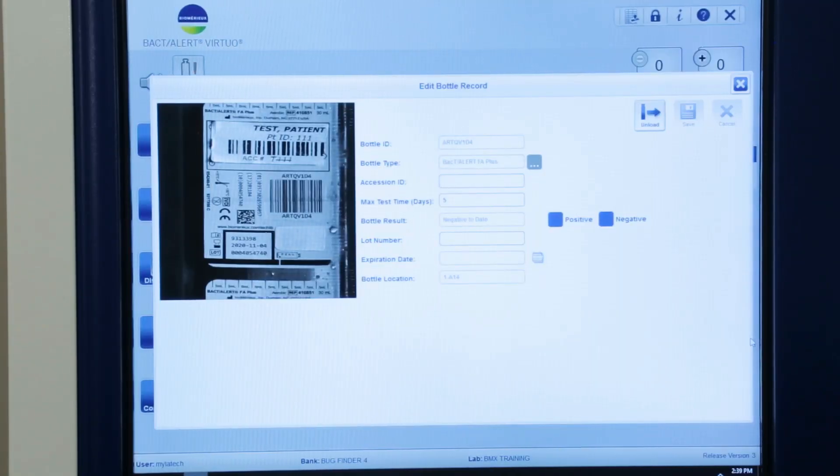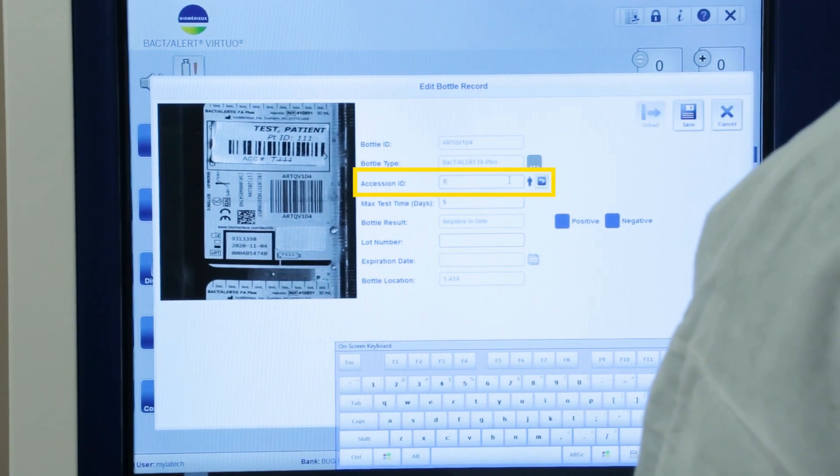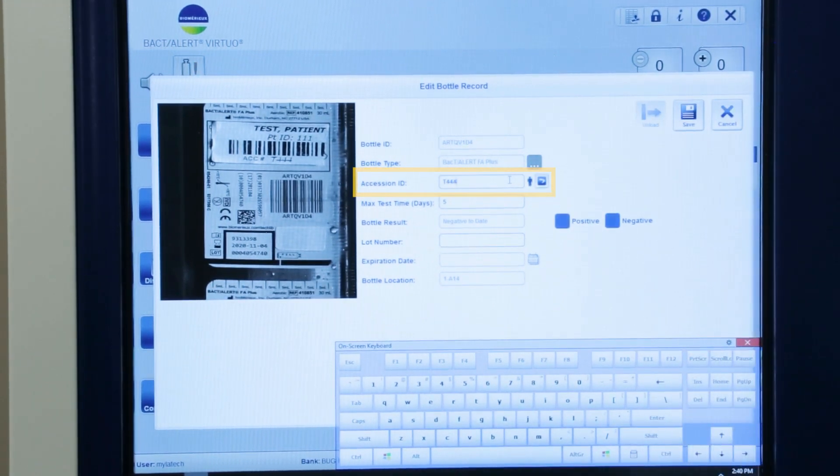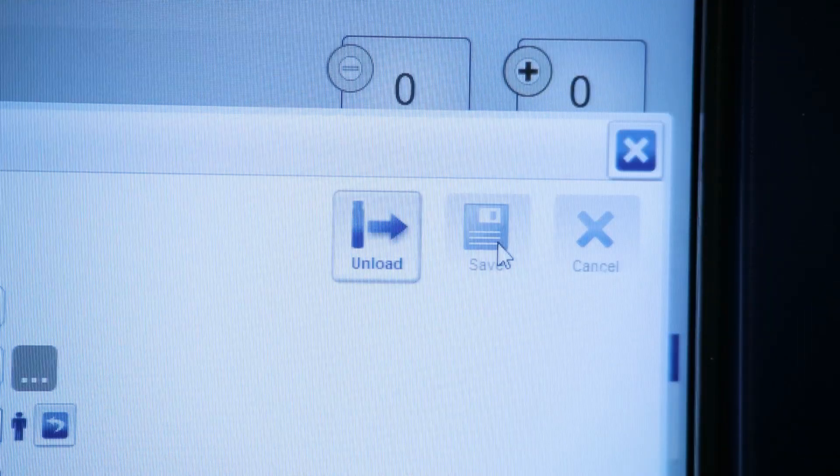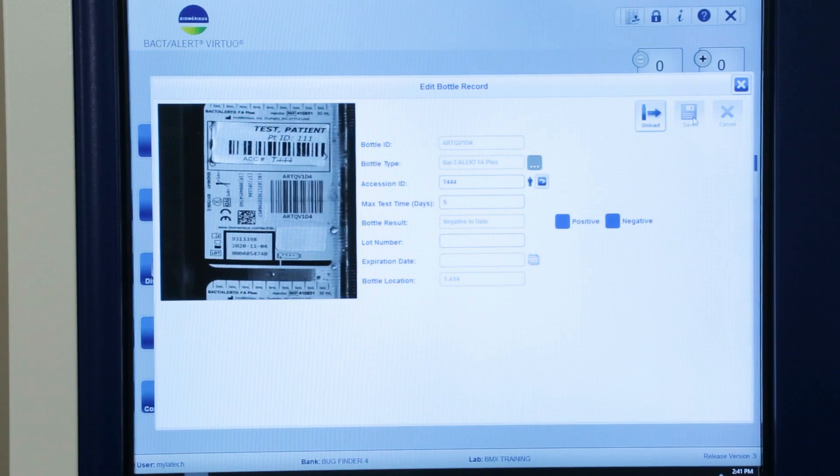From the Edit Bottle Records screen, enter an accession ID in the appropriate field if visible in the image and select Save. This may be done by scanning an additional accession label or typing in the information using the wireless keyboard or touch screen keyboard.